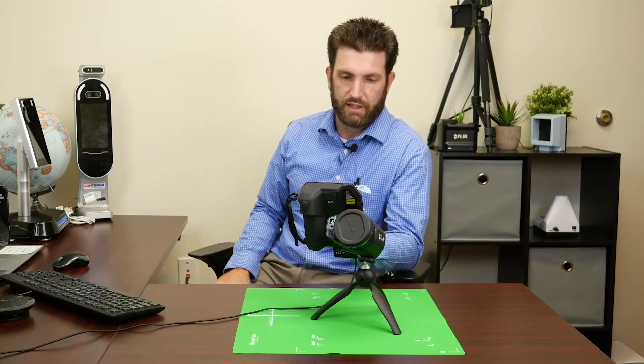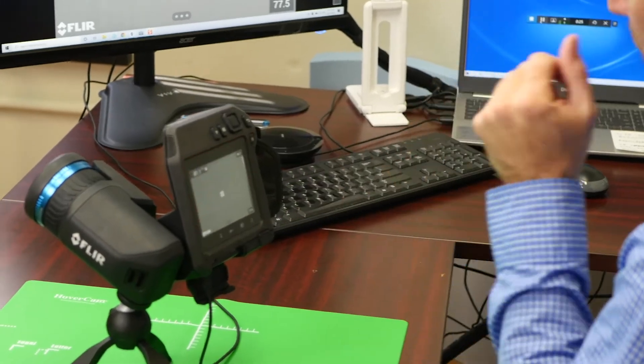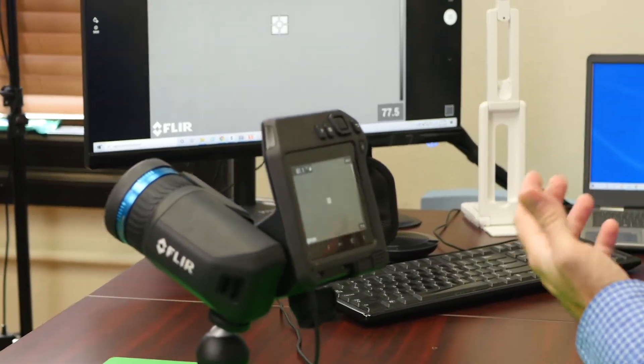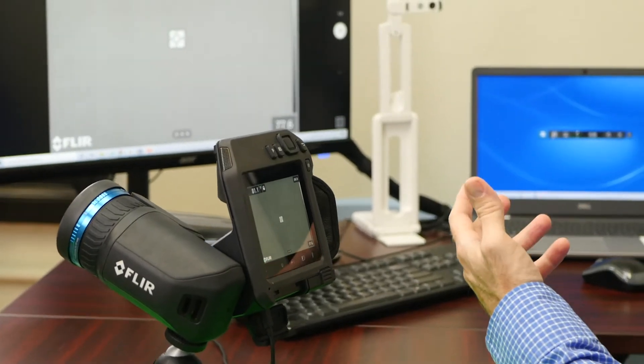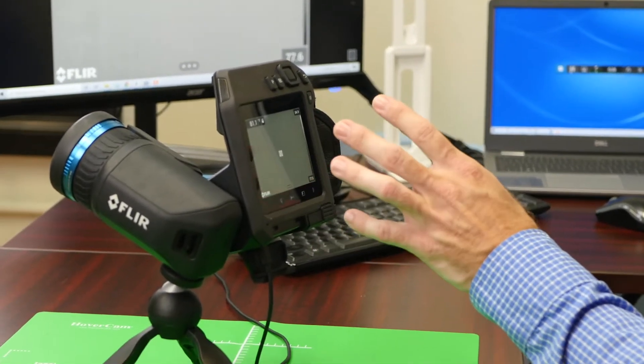So what we're going to be going through today is when you get your FLIR camera out of the box, how to set it up. You put the battery in, press the power button on the top right, and hold that in for approximately three seconds. You will see a screen that says FLIR. After that loads up, it'll bring you to the screen that you're currently seeing right now.